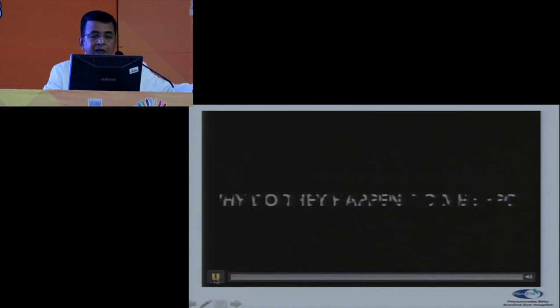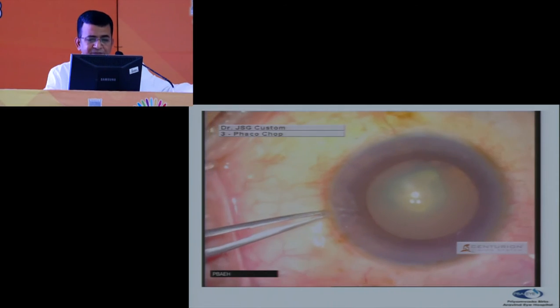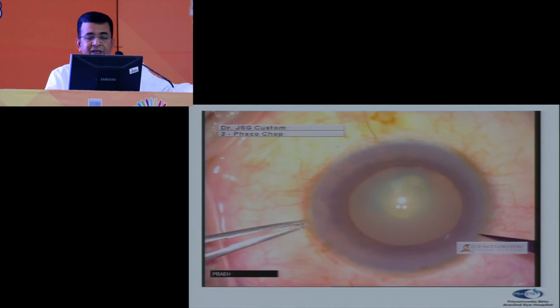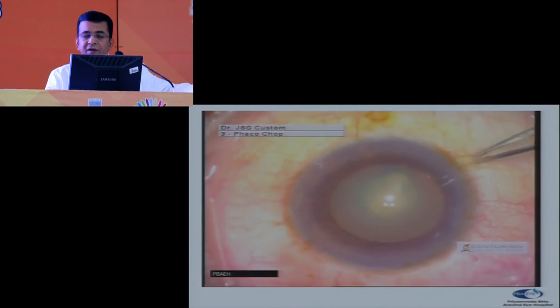So the third case is again another case. I call it, why do they happen to me always? So this was another PPC. Jangshu, do you have a small pupil or IFIS video? I have. Then I think we can skip to that.